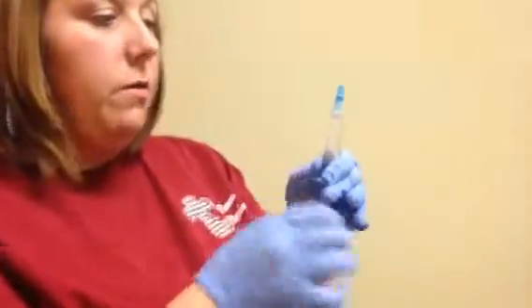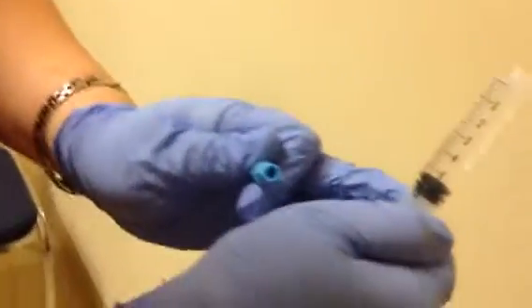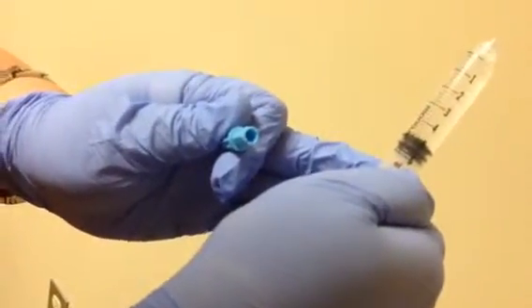So what we're going to do is get our excess saline out. So I'm going to go pour this over the garbage can. So I need 5 milliliters, so I'm going to get my excess out of here. Okay, so I've got 5.